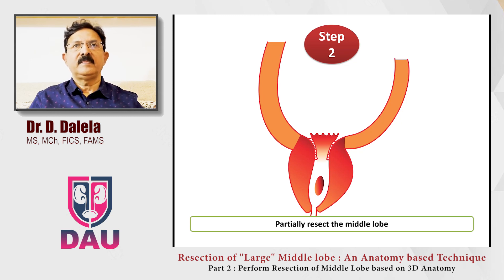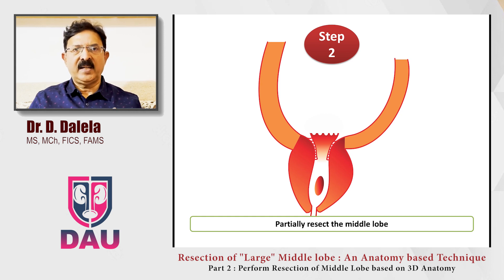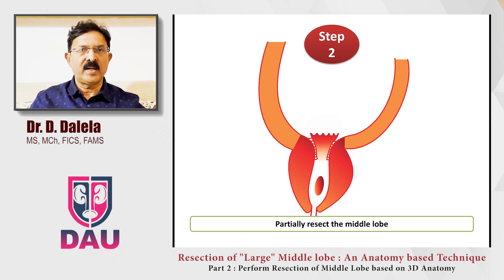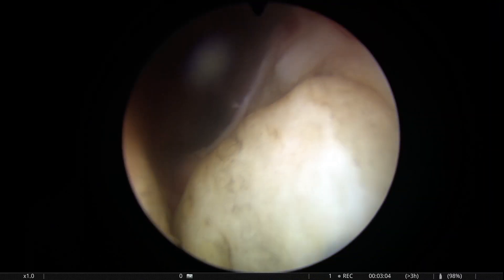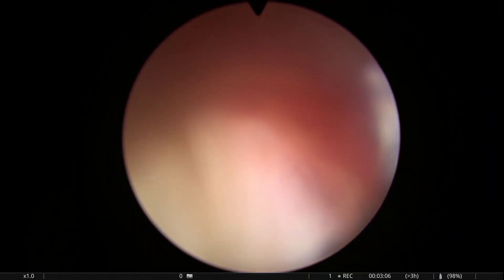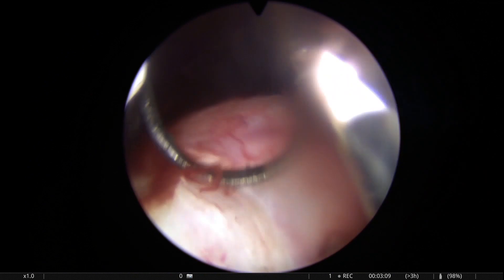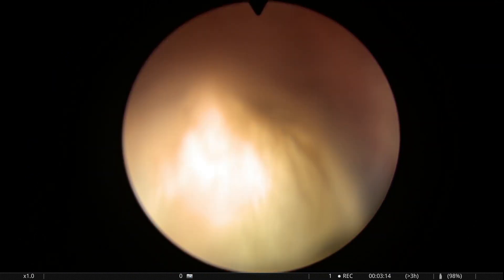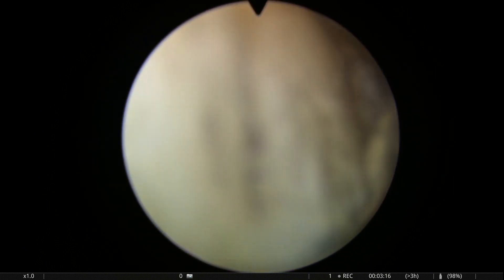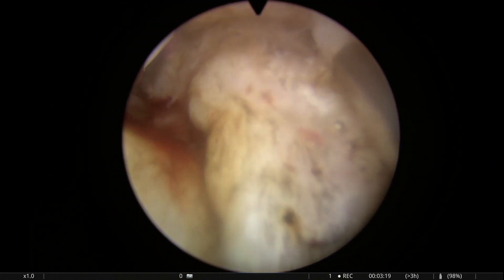The next step would be that whatever is the top part of the middle lobe, you resect that first. Don't resect the middle lobe whole completely — resect the top two-thirds which is protruding into the bladder lumen. Because you have cut two lateral grooves, it has partly devascularized the middle lobe. In this video, you will see that you can resect the top of the middle lobe quickly chip by chip, and it is not bleeding too much because you have already controlled the bleeders from the lateral side.